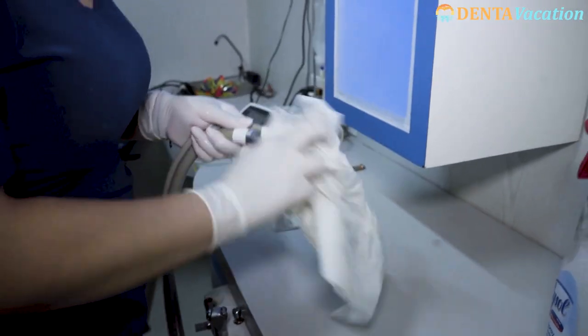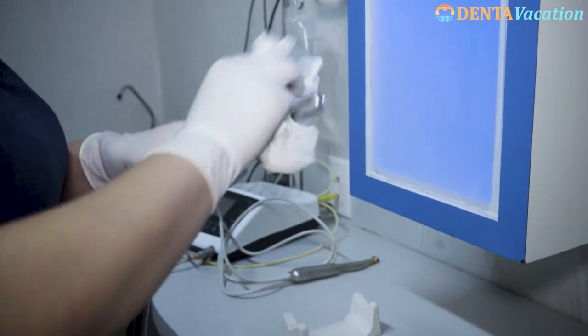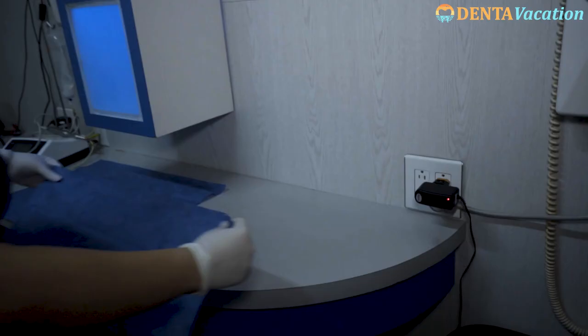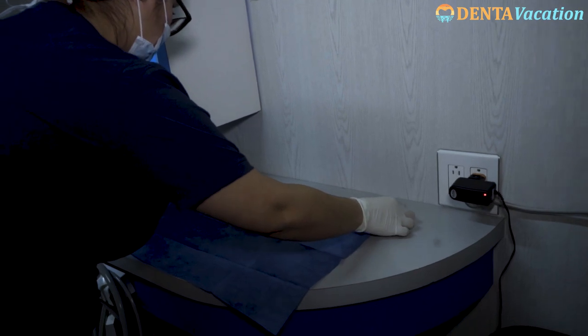Our partner clinics also pay special attention to the dental procedure room. All the tubings and surfaces which come in contact with the patient are wiped with surface disinfectant. Disposable covers are then placed over them.